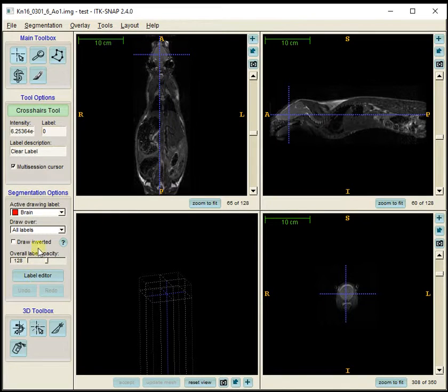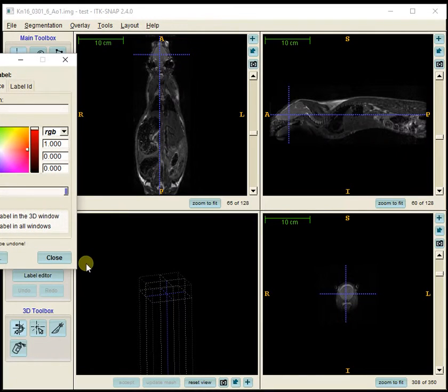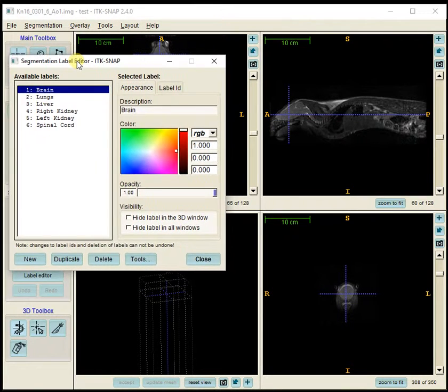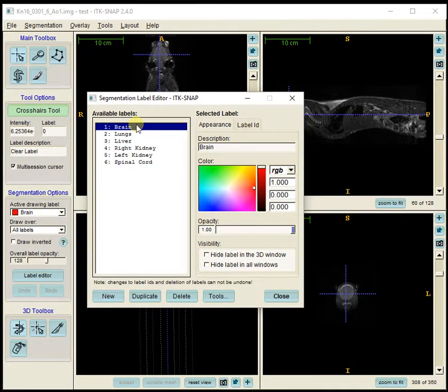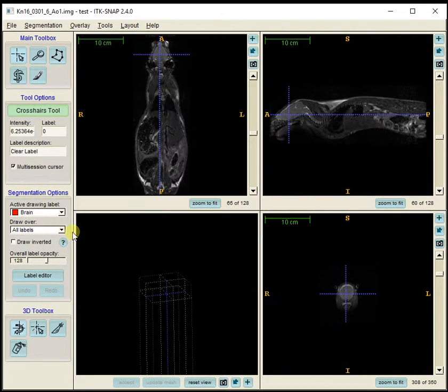Before beginning the segmentation steps, I want to make sure I've correctly labeled my labels. There's a label editor — by default you'd see labels one through six, and I've just renamed them appropriately. Before I begin the segmentation for the brain, I'm going to make sure that my active drawing label is the brain label.